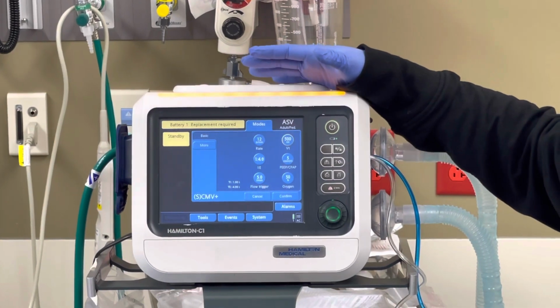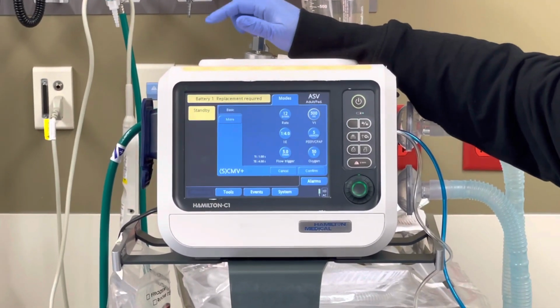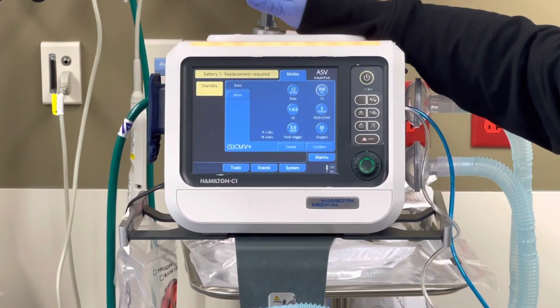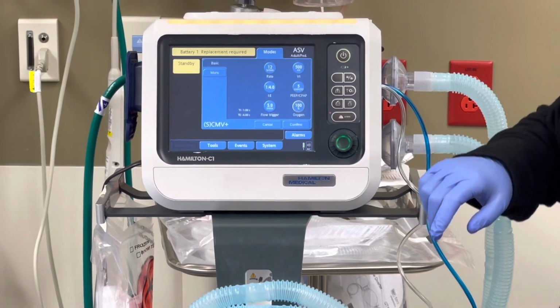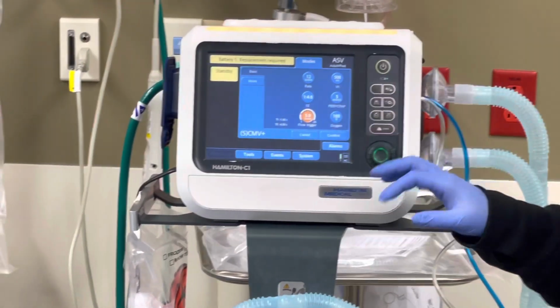I'm usually gonna start with a PEEP of 5 unless I'm noticing that my patient is having difficulty oxygenating when I'm bagging. So if I'm bagging, I'm needing to add a PEEP valve, or I cannot get my sats up, then even on 100% PEEP of 5, most likely that's not gonna help. So what I'm gonna do is I'm gonna dial up that PEEP just a little bit.